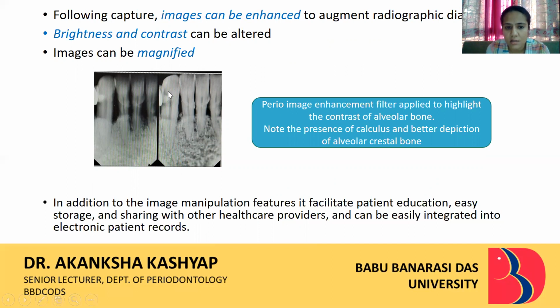Now in this radiograph also, we can appreciate that the calculus is much better depicted, and the alveolar crestal bone depiction is also better than the conventional radiography. In addition to the image manipulation feature, it facilitates patient education, easy storage of the radiographs, and sharing with other healthcare providers.